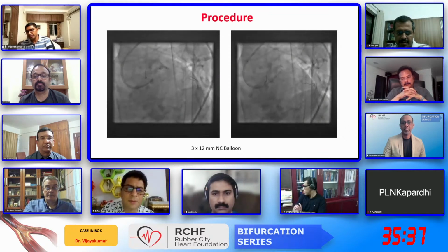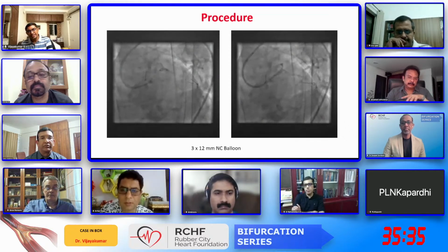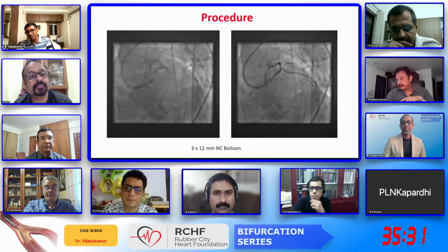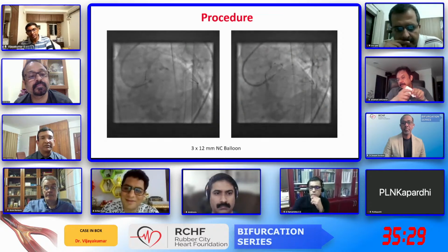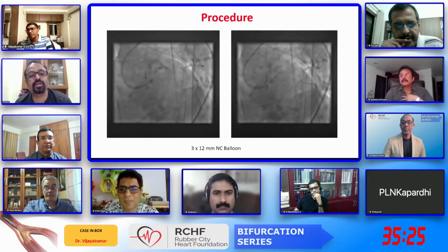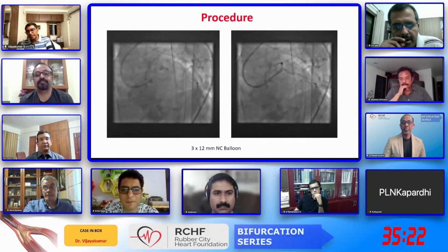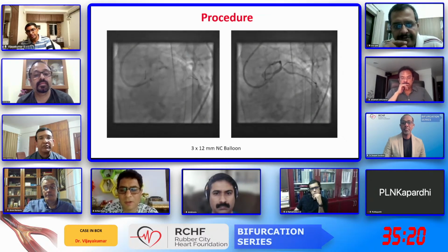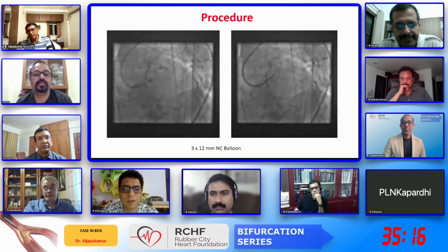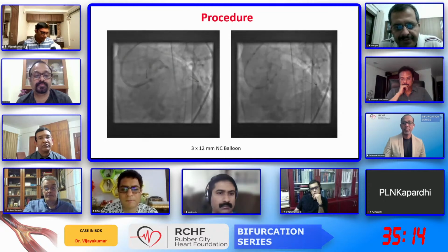First we thought, again, it is cost. I don't know how many balloons we are going to use, but we started with an NC balloon. You are happy with this dilatation? How much pressure, sir? It is 20 plus pressures. Because there's still a significant waist there at the ostium of the circ. Yes, significant waist was there.